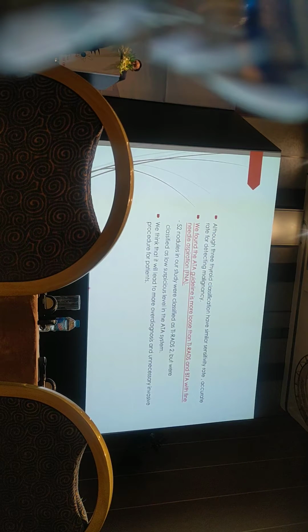In our study, we also have a similar problem, because we found that 52 nodules were classified as TI-RADS 2 level. But if we use the ATA classification, these nodules are classified at a low suspicion level. It means that if you use the ATA level, these 52 nodules should undergo biopsy. So we think that it will lead to more overdiagnosis and unnecessary invasive procedures for the patient.